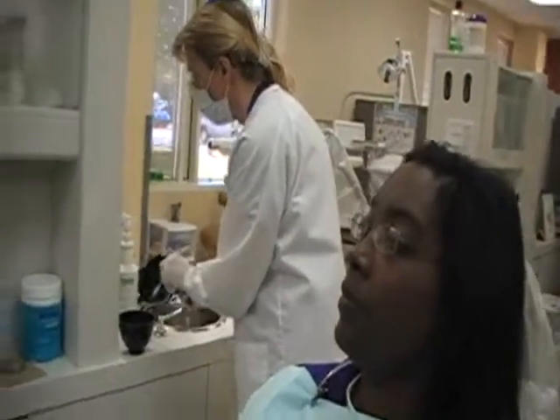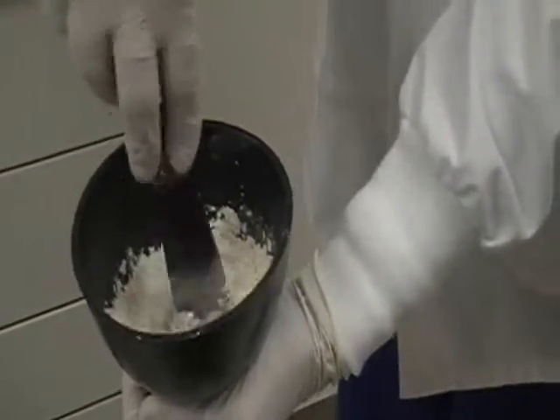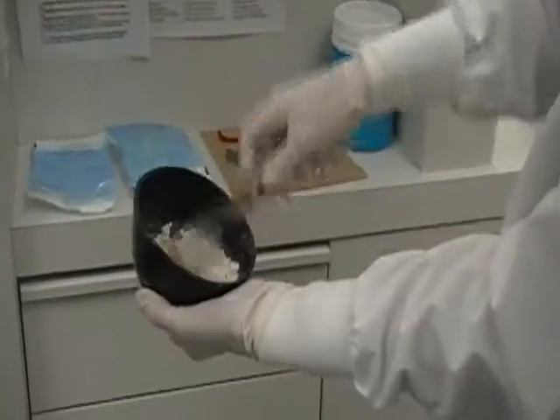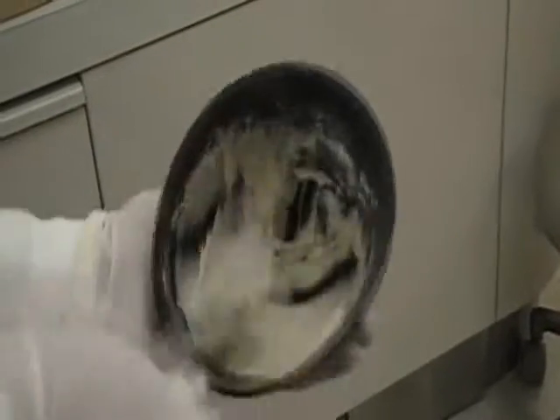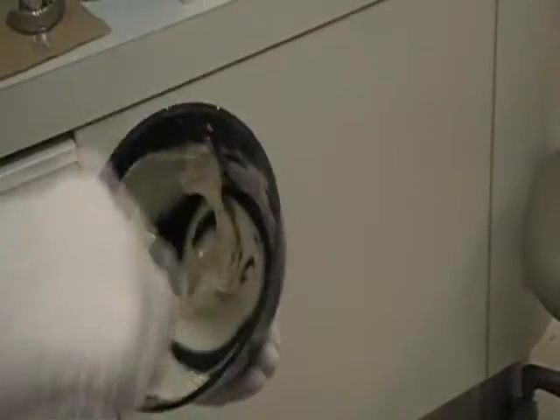I'm now adding the powder to the liquid. You want to wet the powder particles. Now you want to hold the bowl to its side and you want to begin what's called a stropping motion — back and forth, back and forth. What you're looking for is a very smooth, creamy mixture with all the powder particles mixed in. It should take about a minute from when you add the water.